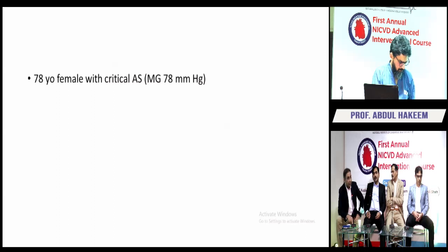And if you come down to the bifurcation of the aorta, then we should look for the size of the external iliacs. We should know the size of the access site vessels, whether these are the femorals, or we are planning from the axillary, or in some specialized centers, transcaval and transcarotid. So the ejection fraction of the patient, renal function, all these are important factors that you should know before planning to go for TAVI in such patients.